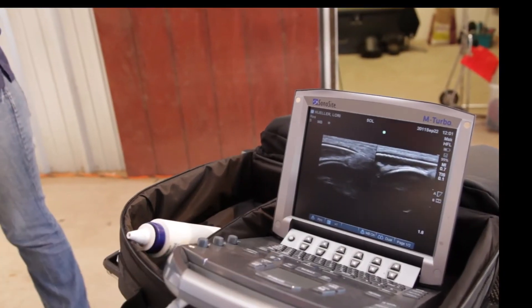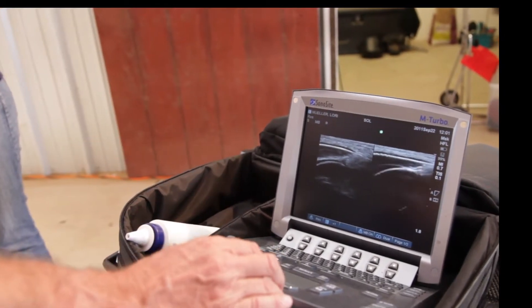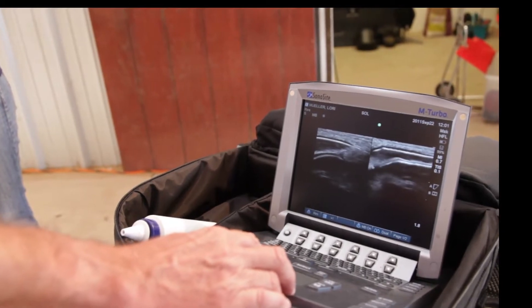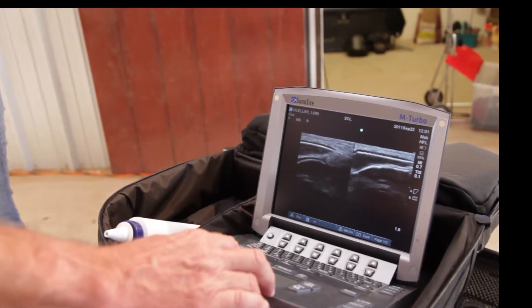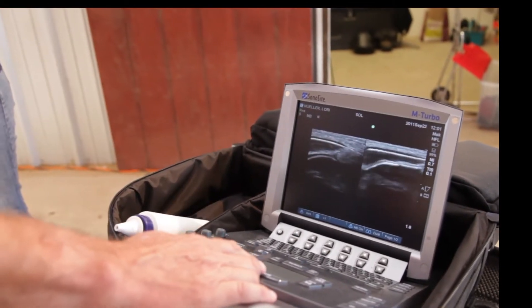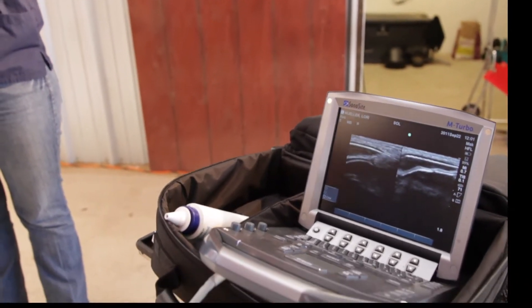Ultrasound exam of the eye is done in a short axis and a long axis, and the eyeball looks very normal — the retina, the lens, the anterior chamber, posterior chamber. So this is a normal ultrasound exam of the eye. This will help us in our therapy.